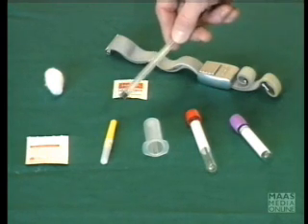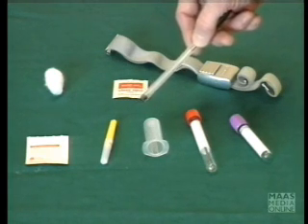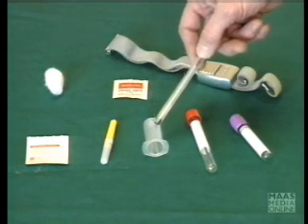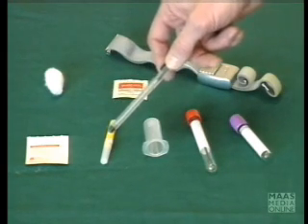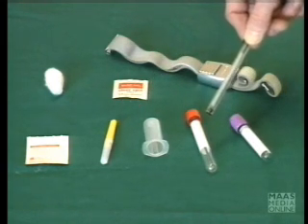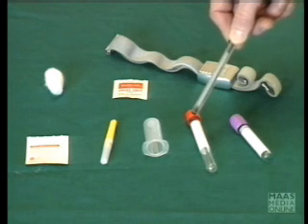Down here, we have some of the basic equipment for the collection of blood. We have the vacutainer holder, we have the needle, and we have just two of the several sample tubes which are used in this hospital. I'll show you the rest of them later on in the discussion.